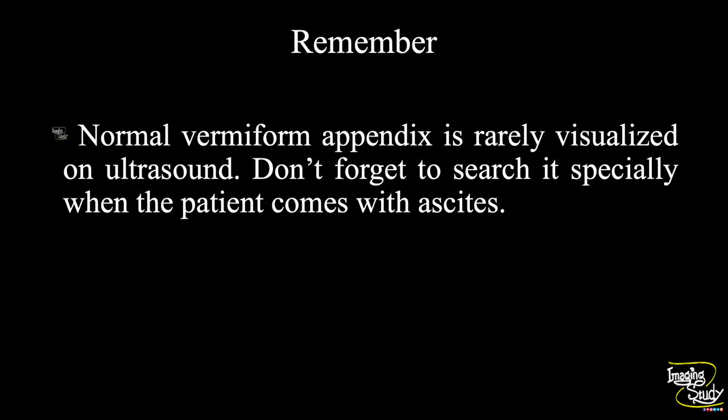Now the take-home message. The normal vermiform appendix is rarely visualized in regular ultrasound. Here is a short trick for beginners: don't forget to search for the vermiform appendix especially when the patient comes with severe ascites. You may see the vermiform appendix at the right iliac fossa due to the large adjacent collection.